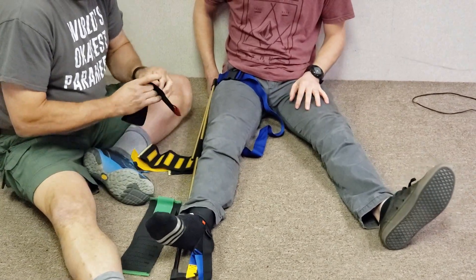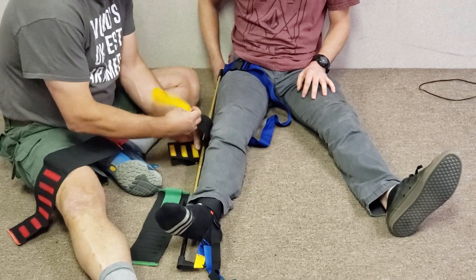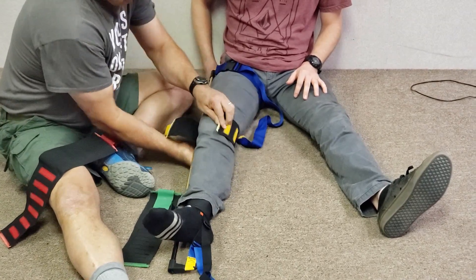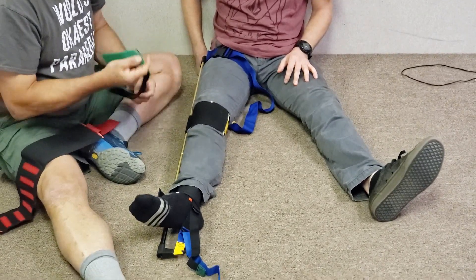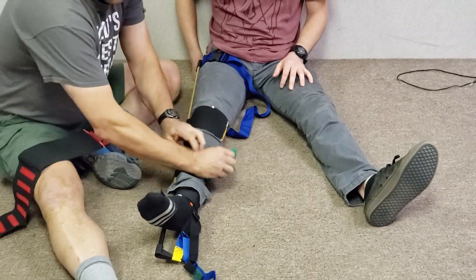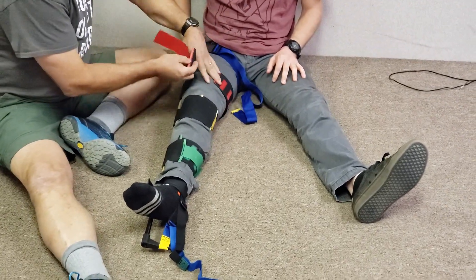The purpose of the straps is twofold. Primarily, they need to marry the pole to the leg, because if the leg can bend there's no traction. The second function relates to the thigh strap, which can serve as a compressive dressing. Remember, a broken femur causes hemorrhaging in the muscles, so that strap can be very useful — especially when you have an open femur fracture where the muscle is bulging out or the bone has lost its integrity.